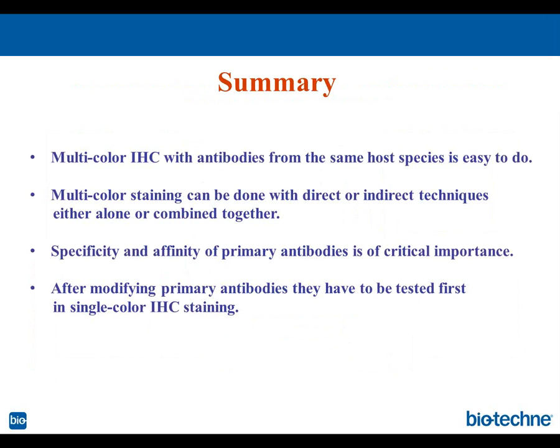I can tell you that paraffin-embedded tissue sections are less vulnerable to the antigen retrieval procedure versus cryostat sections. Cryostat sections, or frozen tissue sections, are really sensitive, and you're correct, there's physical damage to the tissue. But only trying to find better slides, so that the tissue will stick better to the slides, is the only way to do it.